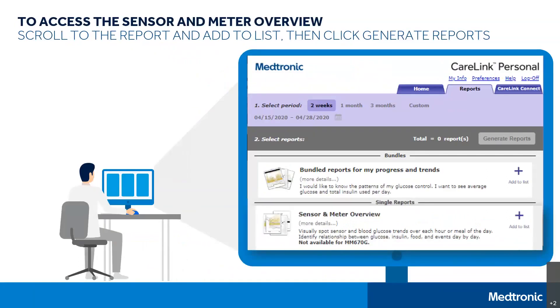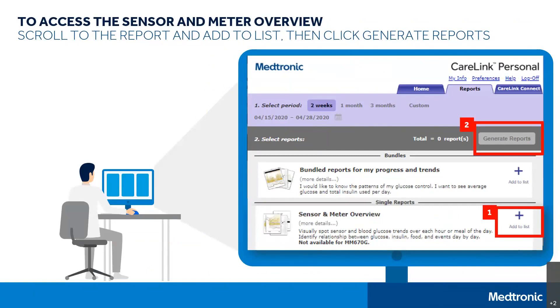Once you've selected the Reports tab, select the report you want to review by clicking Add to the list, and then select Generate Reports. You can generate reports by time frame — for example, by weeks or by months shown at the top — or you can customize to a specific time frame.